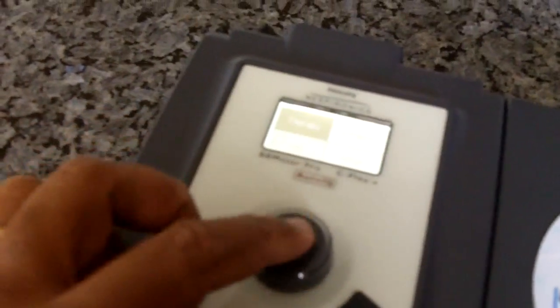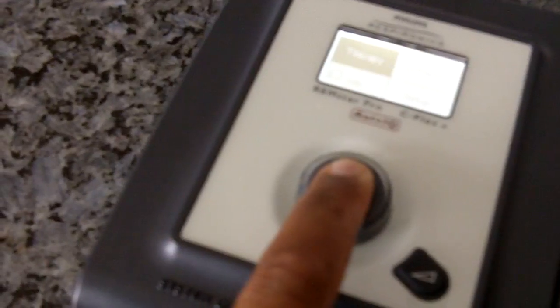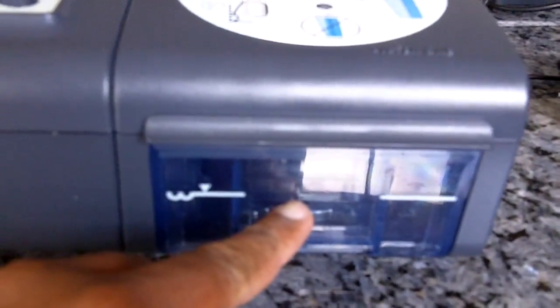Okay? First, turn it on and decide what heat setting you want. So I'm going to leave it at 2. Now I want you to hold this button and just hold it down till the heating symbol appears. And I'll show it to you. There it goes. Alright? Now the preheating function has begun.